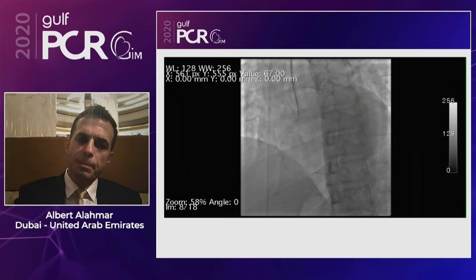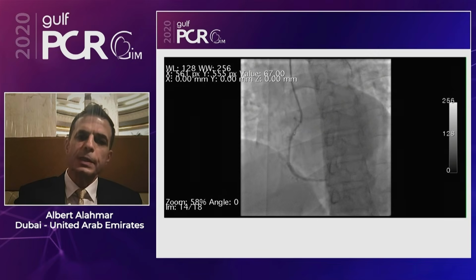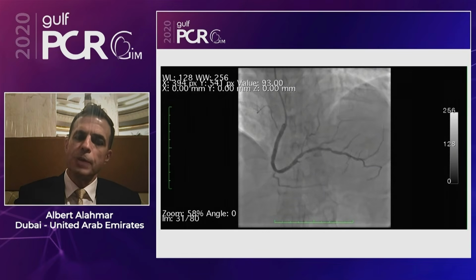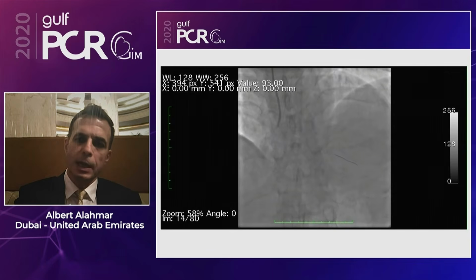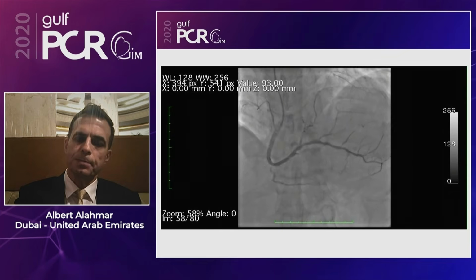So we stabilized the patient by doing the right coronary artery, and my plan was to bring him back to address his left side. I'll show you the left side diagnostic pictures. This is the final picture of his right coronary artery with a large 4.0 stent in his proximal RCA. And you can see the retrograde filling collaterals towards his left system.